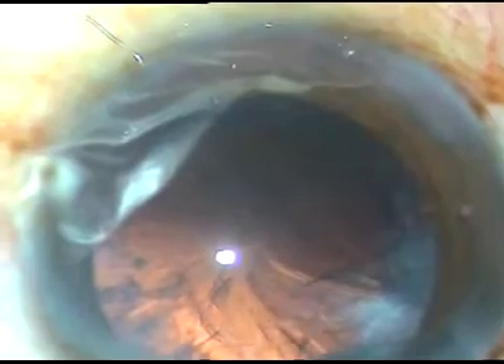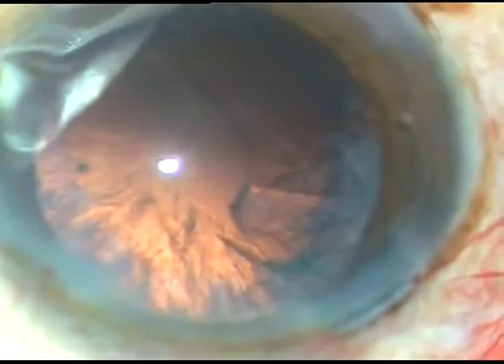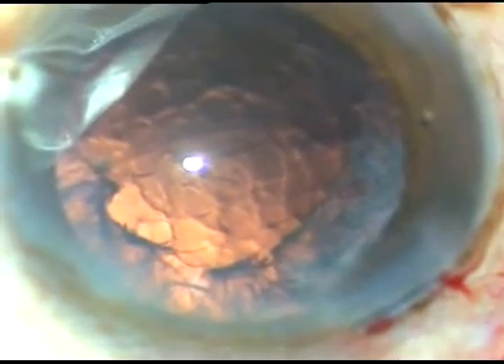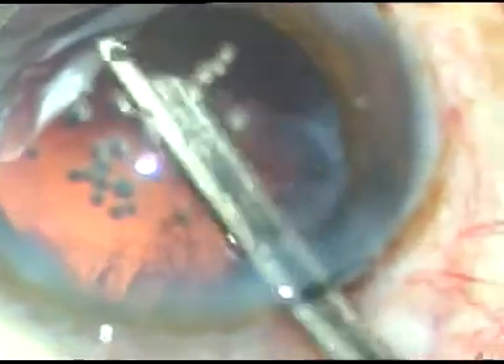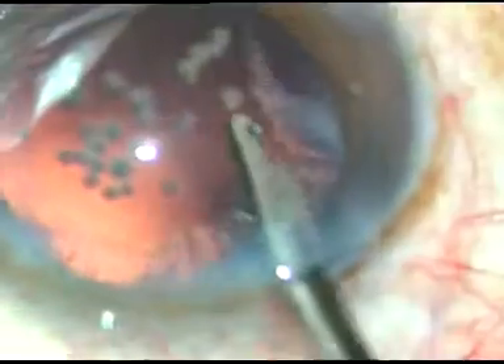That's it — the nucleus is managed. Now HPMC is injected again into the anterior chamber. A Simcoe cannula is being used to remove the cortex. There is a lot of cortex in this case, and the Simcoe cannula is being used to remove that.